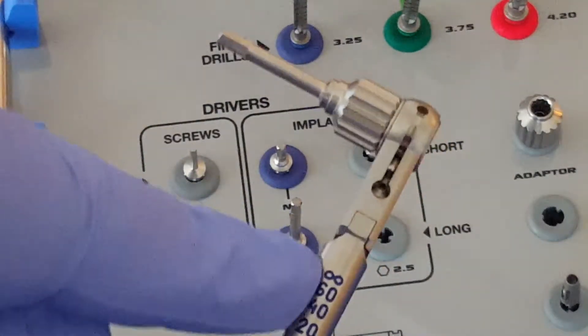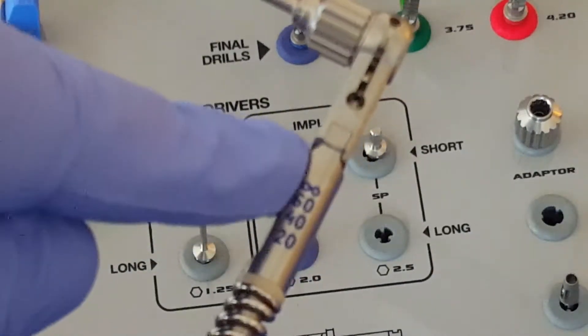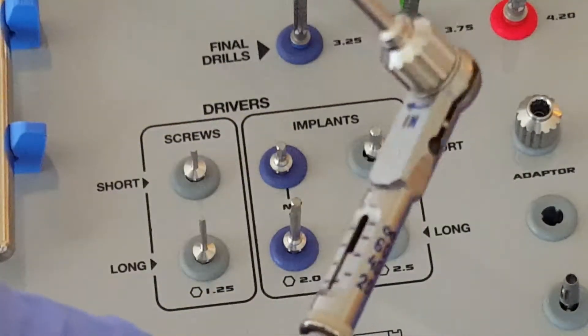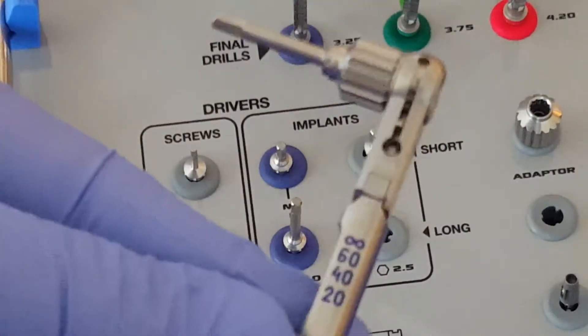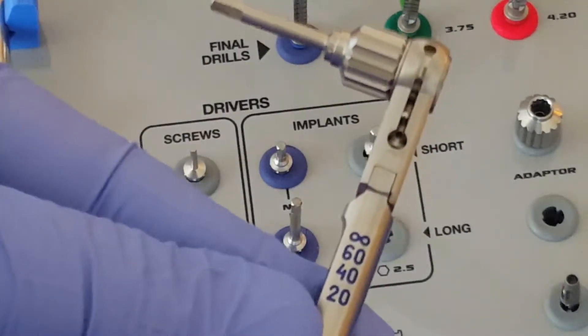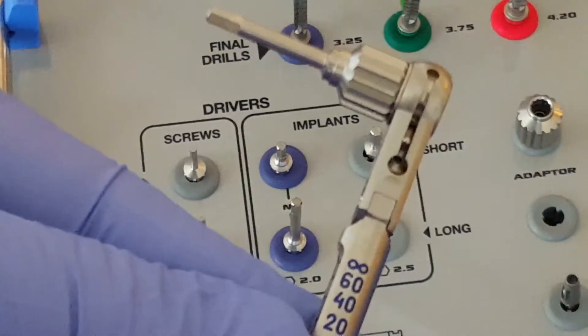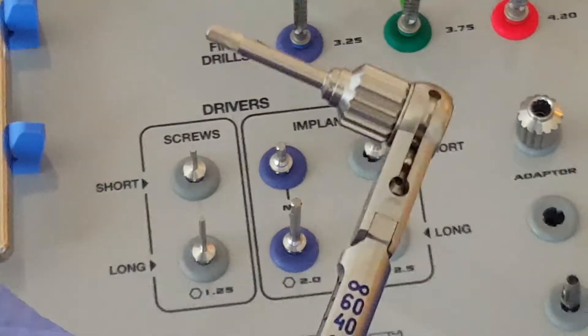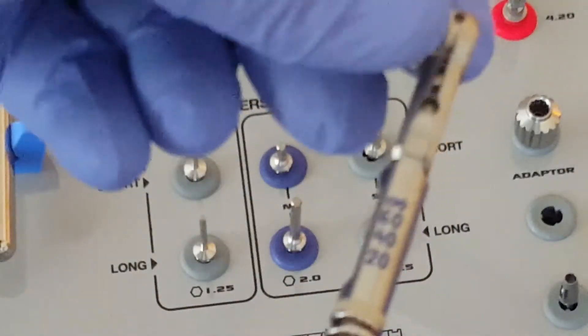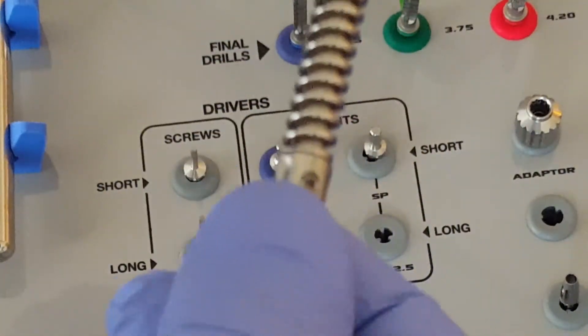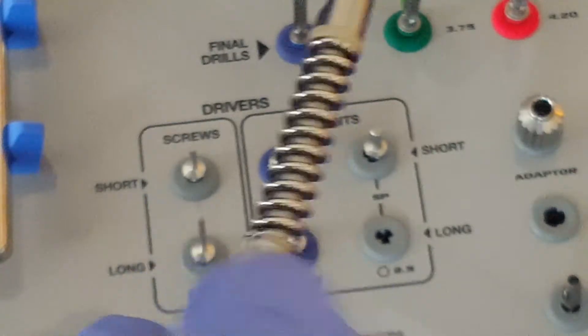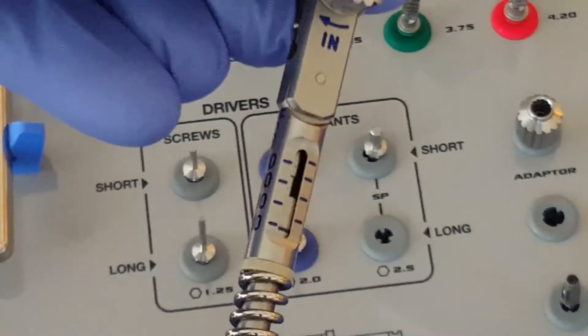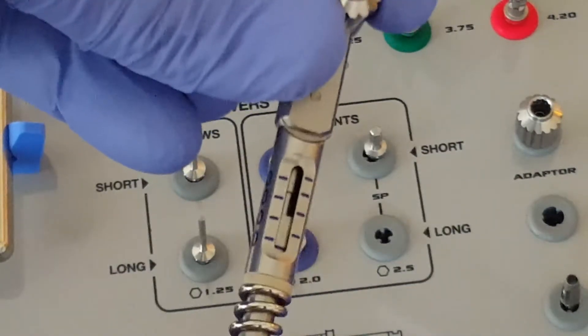Now we can utilize these numbers, 20, 40, 60, 80 newton centimeter, to set the appropriate insertion torque. For the Paltop implants, we generally recommend not to exceed between, or like to be between 30 and 40 newton centimeter. The adjustment of this can be done by rotating the handle. When you rotate it, it will change the position of the setting.